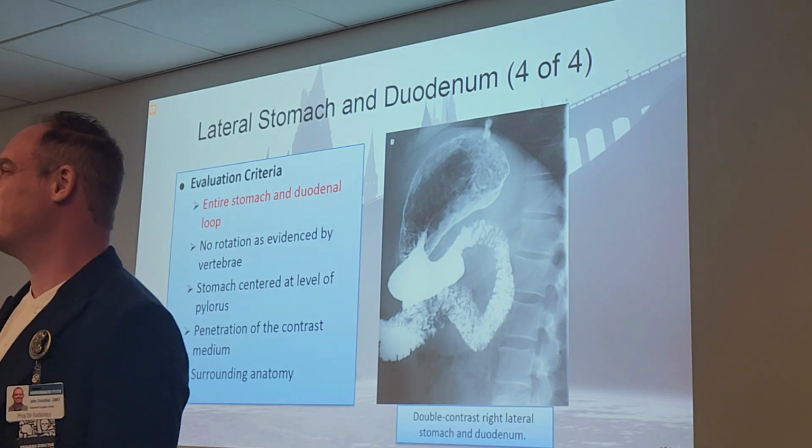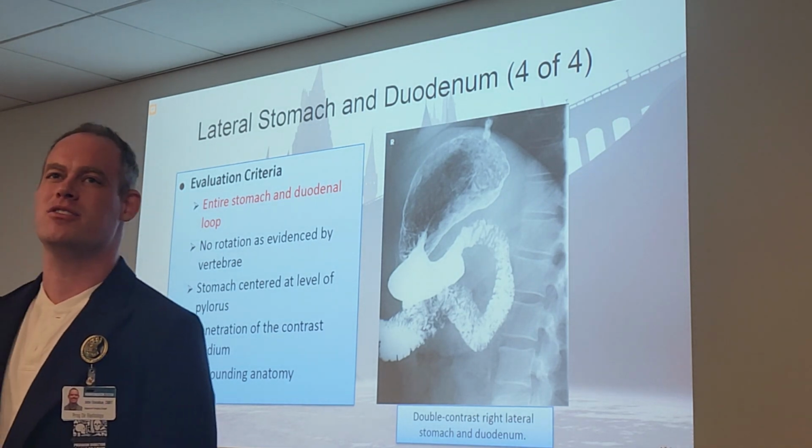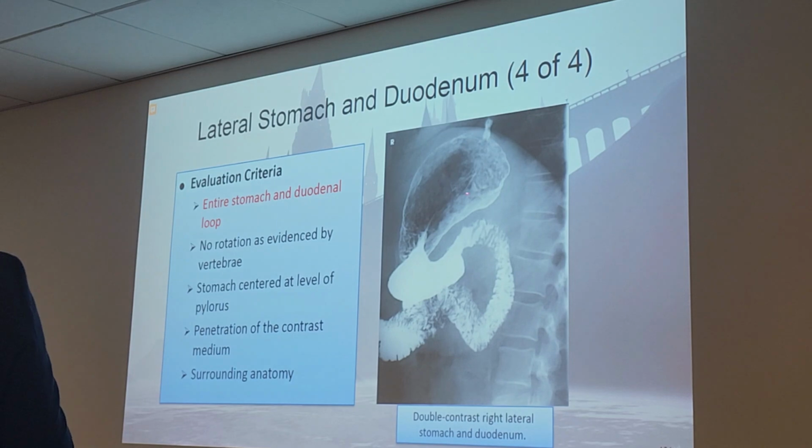Okay, so what are we interested in again? Entire stomach and that duodenal loop portion. That's the main stars of our show for our lateral stomach and duodenum. That's a very pretty picture there. We actually got it all on that one. There's your fundus, there's your body and pylorus, there's your C loop.